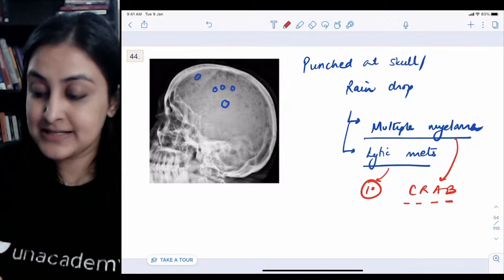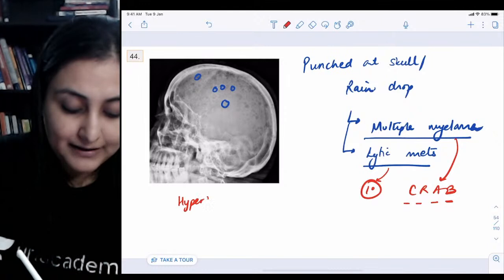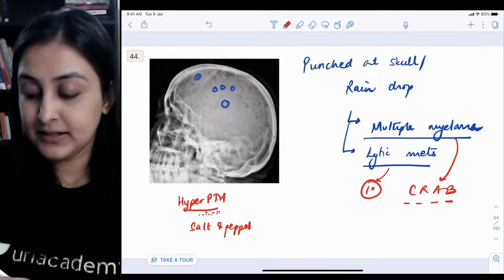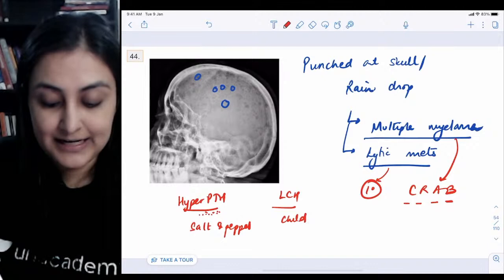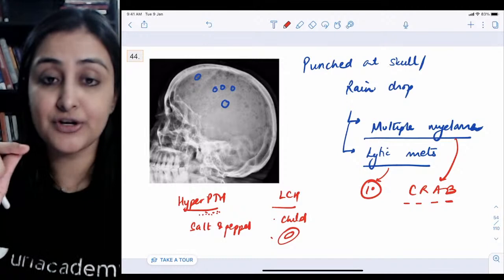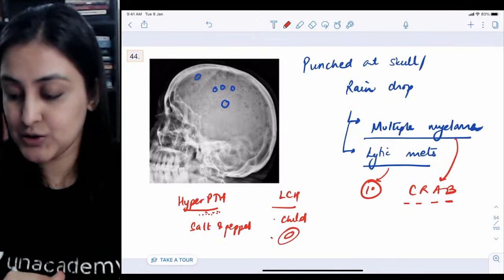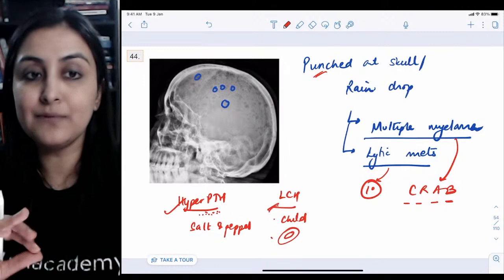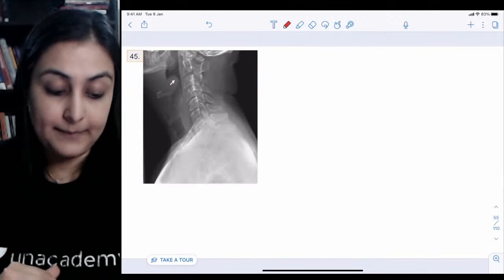To distinguish: multiple myeloma will have associated CRAB features — hypercalcemia, renal failure, anemia, and bony lesions. Lytic metastasis will have a history of primary malignancy. Hyperparathyroidism shows tiny lytic lesions called salt-and-pepper skull. LCH occurs in a child with large geographical lesions with beveled margins. So the continuum is: very small lesions in HPT, middle-sized punched-out lesions in myeloma, and very large geographical lesions in LCH.